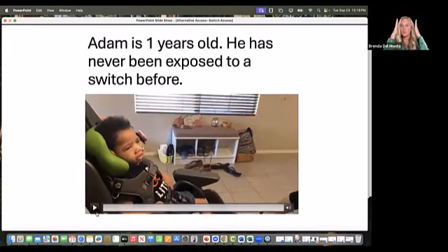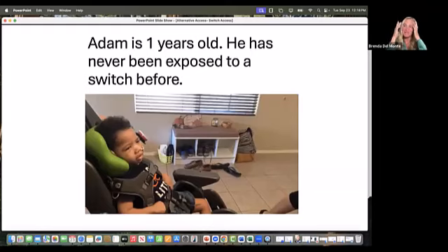So what he's doing here is one switch is his scan, and I usually make that red because he can't see the switches, but I like it for my paraeducators and others. It's basically a not that one, not that one, not that one. The green is that one, and that's select, but if you don't have different colors, don't worry about it. So he's doing music and Five Sharks and read a book or Kisses from Mom or something like that.